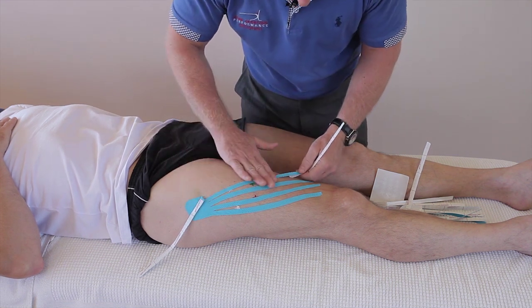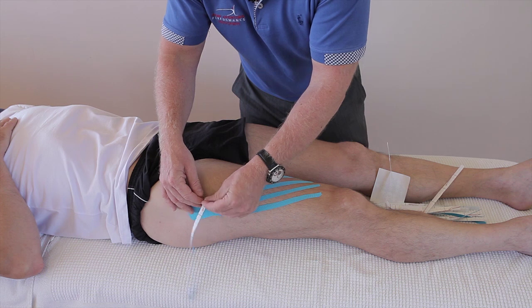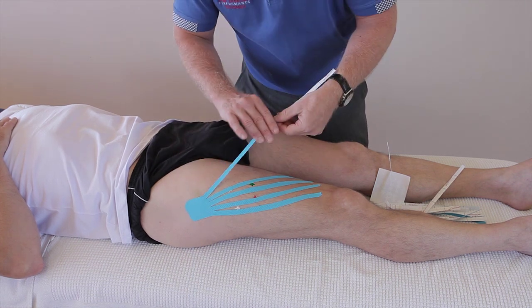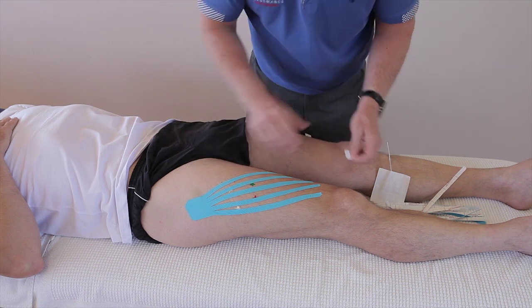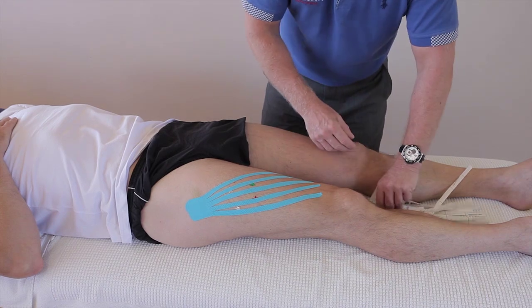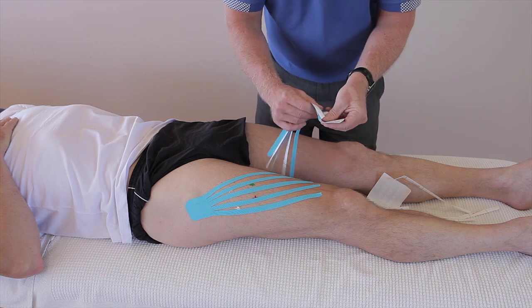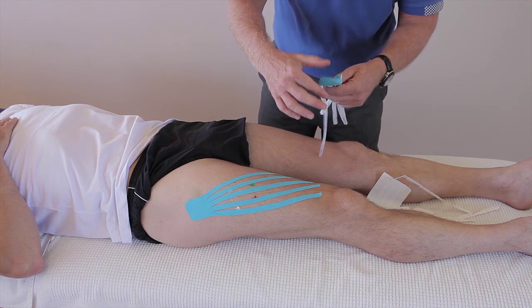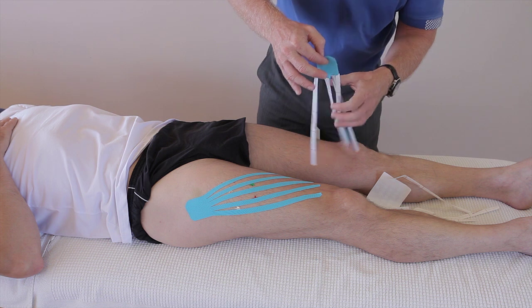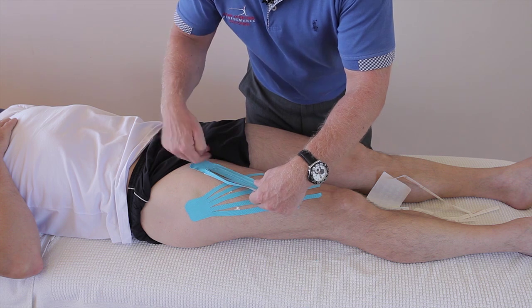You can still ice directly over this tape and it's safe to do that. Just be careful with a hematoma — if it's actually an intramuscular hematoma then that's bleeding within the muscle. Sometimes you can get a complication where there's an intermuscular hematoma, and it tends to bleed between the sheath of each of the muscles, so you tend to get gravitational bleeding.